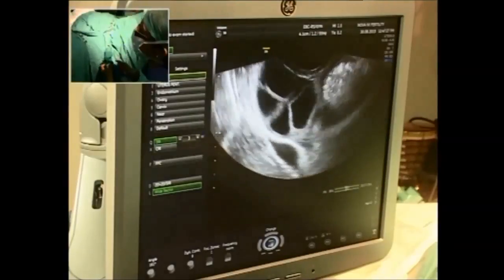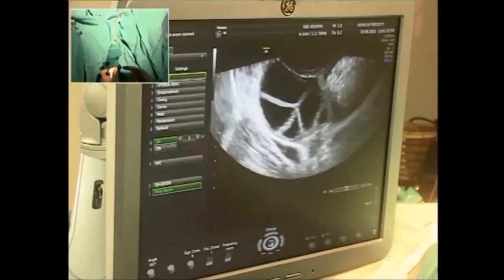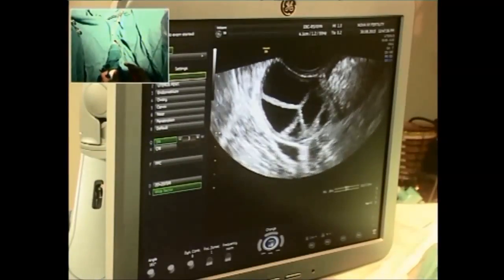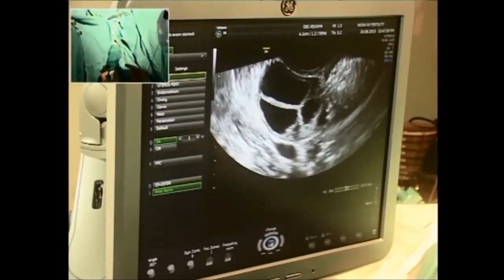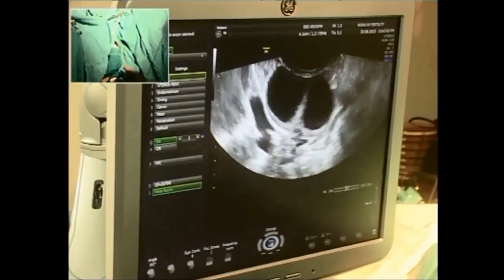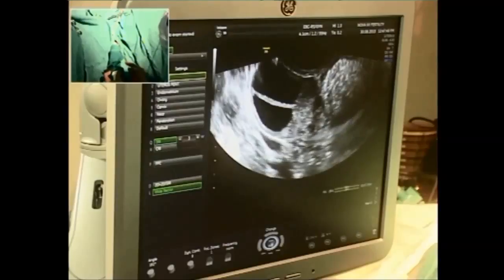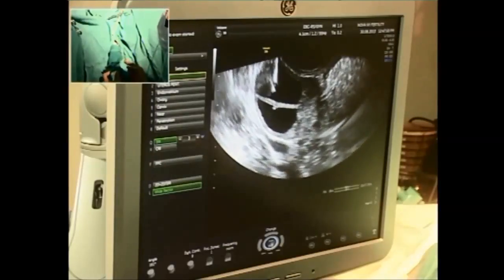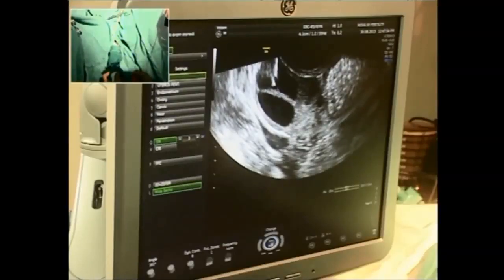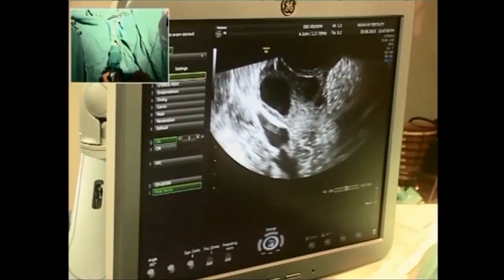This is a 34-year-old lady with secondary infertility with tubal block, going for her first round of IVF — antagonist stimulation with HMG 450 units. This is her left ovary and the stimulation is quite reasonably good. I'm going to put my needle in and try to demonstrate the technique.